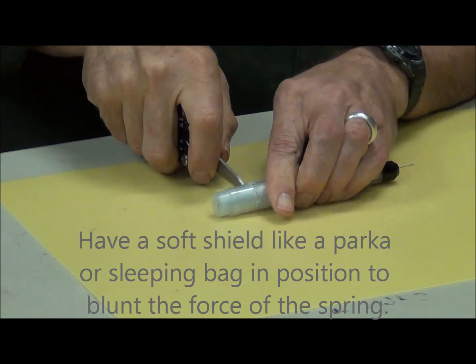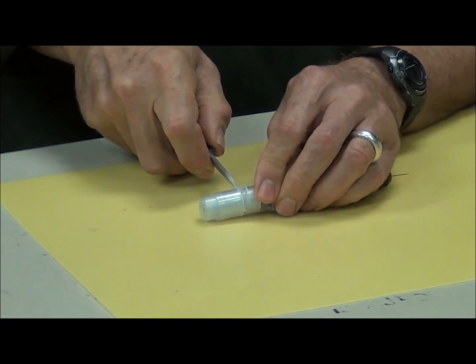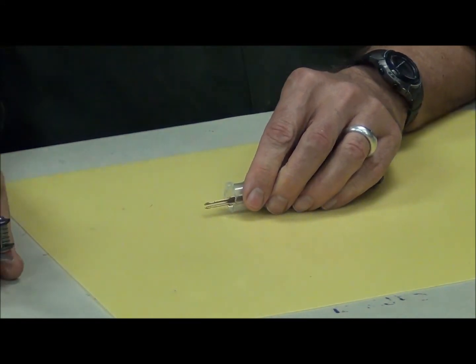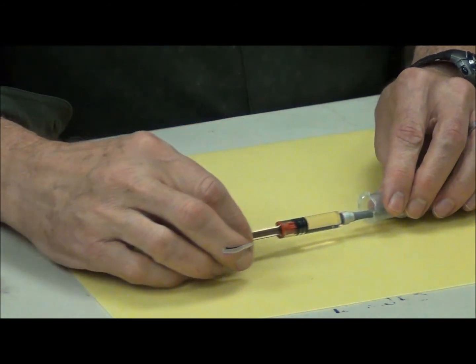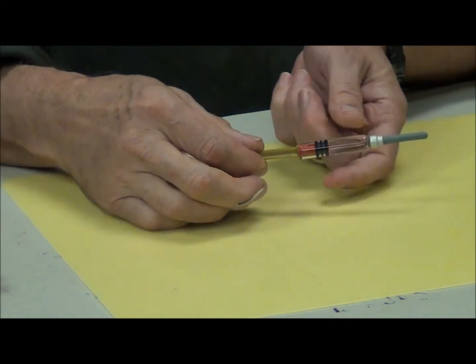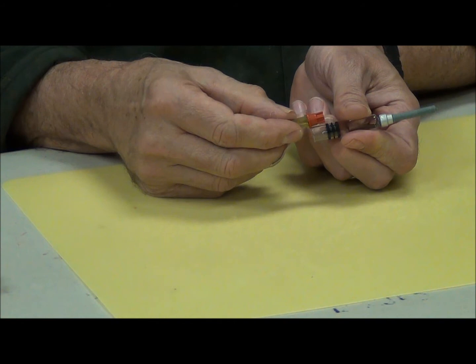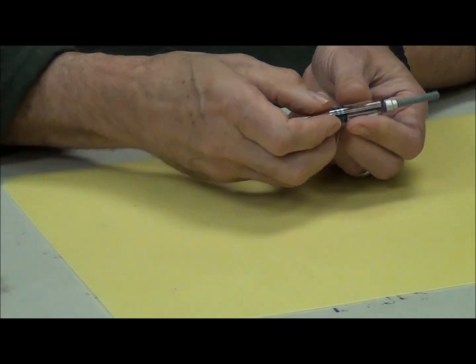And it's about to shoot. And you want to be sure no one's standing in the way when that happens. At this point in the old pen, you take the cartridge out of the case and it will simply unscrew. You can see that this red stopper has a flange that stops it from going any further. If you turn this around, you can now use it to inject the rest of the epinephrine that's in the syringe.